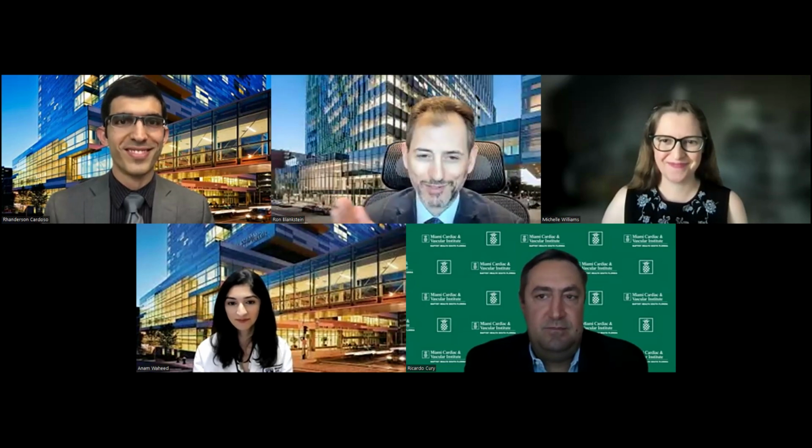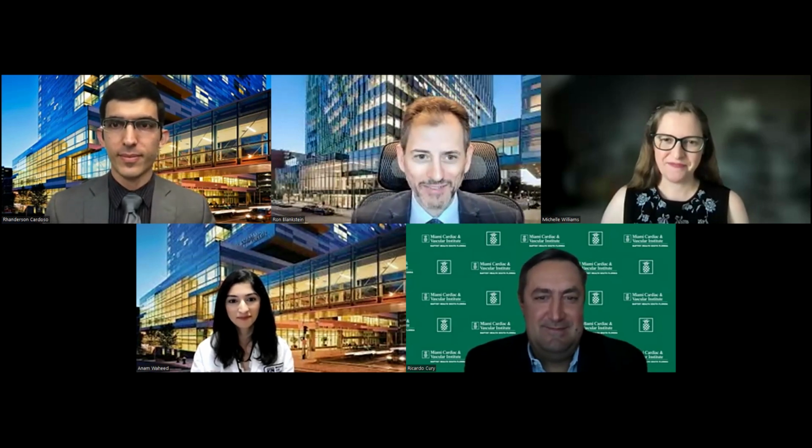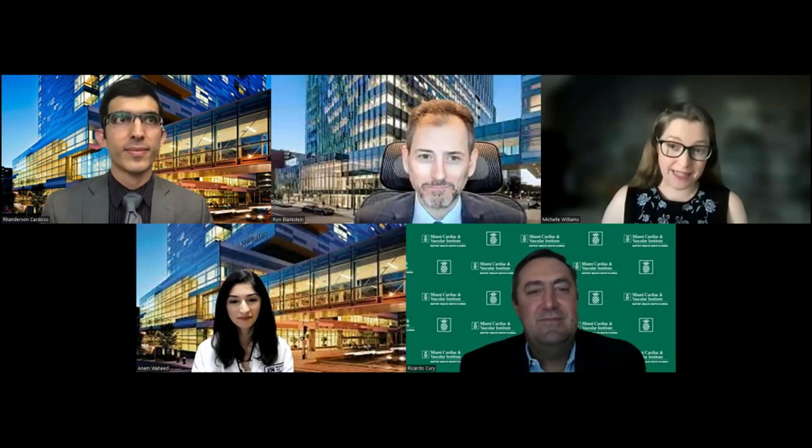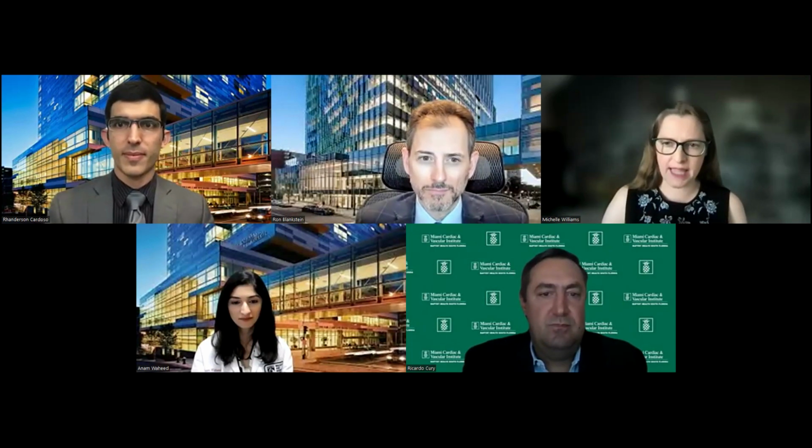But on that topic, it reminds me of a tweet I saw over the weekend from the NASCI meeting. Someone had a mnemonic just to remember the order of all the different modifiers. And of course, we like to keep this simple. We don't want you to have a mnemonic. So Michelle, tell us some advice on the order of modifiers. Does it matter? The simple answer to that is no. There are two things that do matter. First is stenosis. Second is plaque. And after that, put the modifiers in any order you fancy. As long as they're there, it doesn't really matter what order they're in. But first stenosis, second plaque, and then everything else.